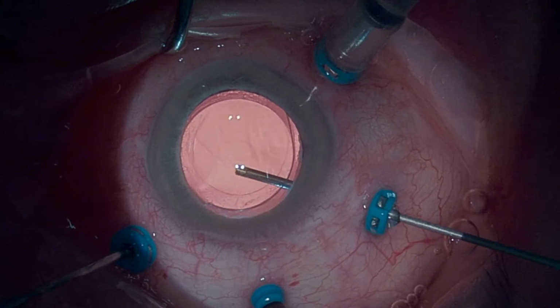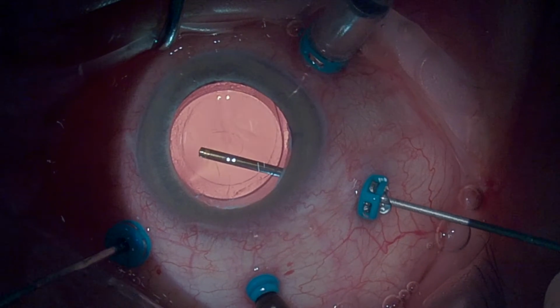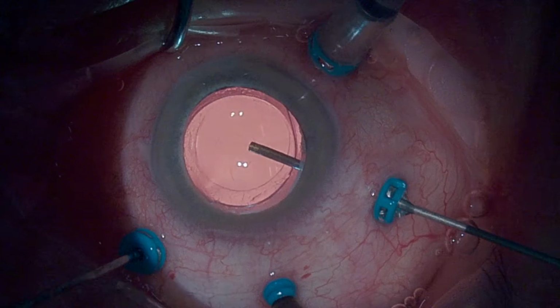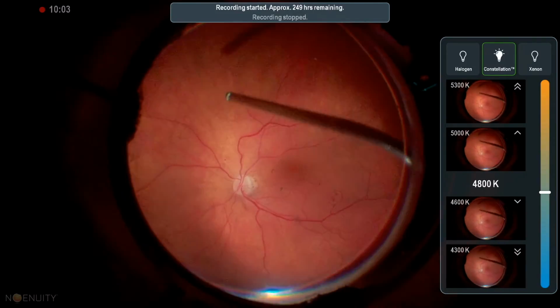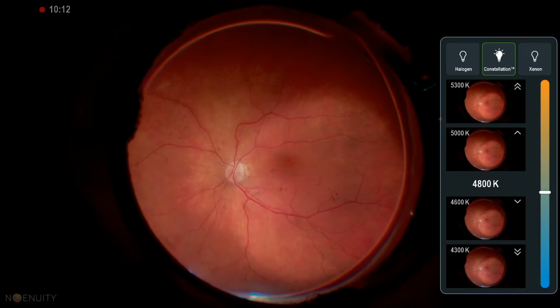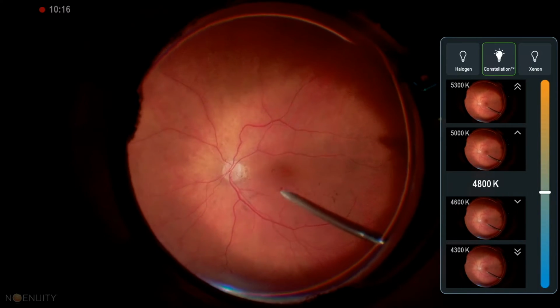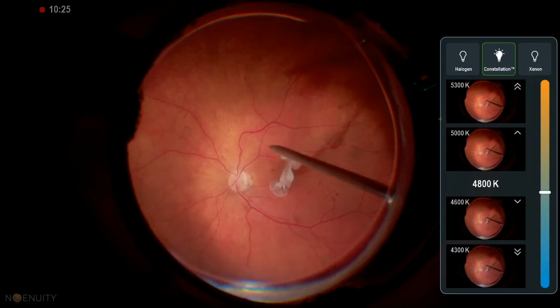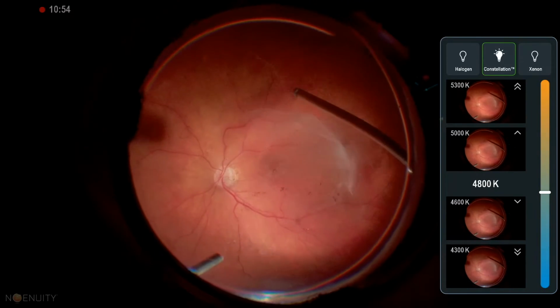At the beginning of the surgery, the surgeon uses direct visualization through the microscope to perform the vitrectomy in the region posterior to the intraocular lens, removing the anterior hyalloid. After the core vitrectomy, he injects a small amount of intravitreal triamcinolone to stain the posterior hyalloid membrane, which is diffusely adherent to the macular region.